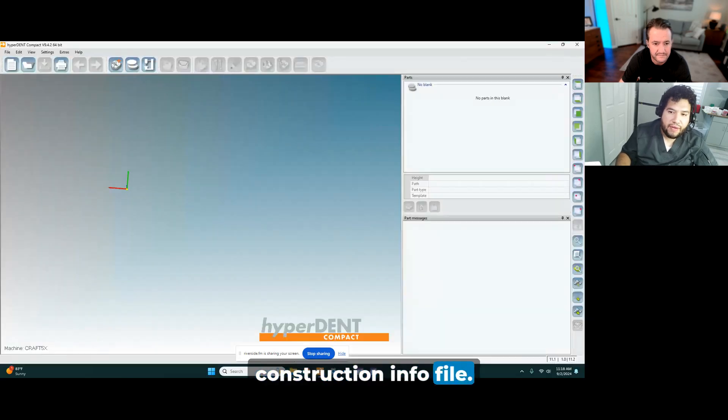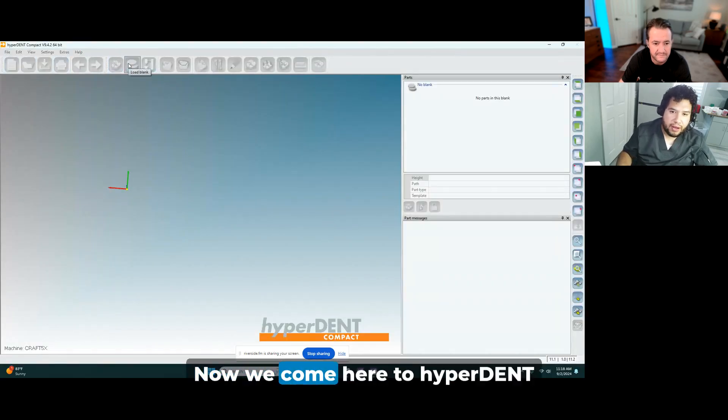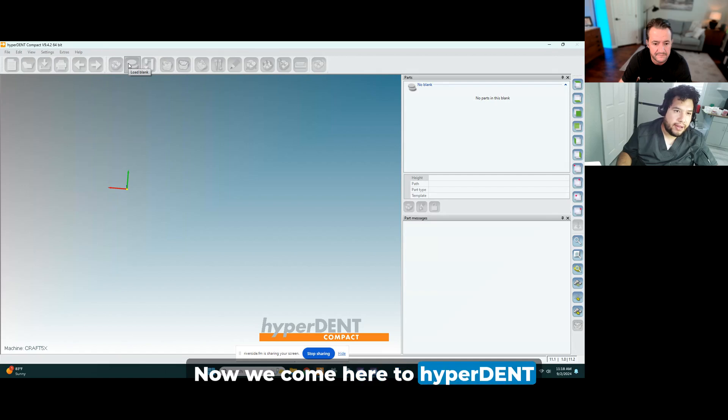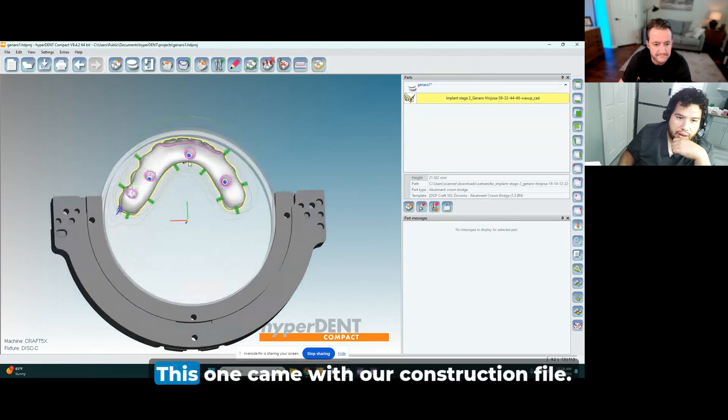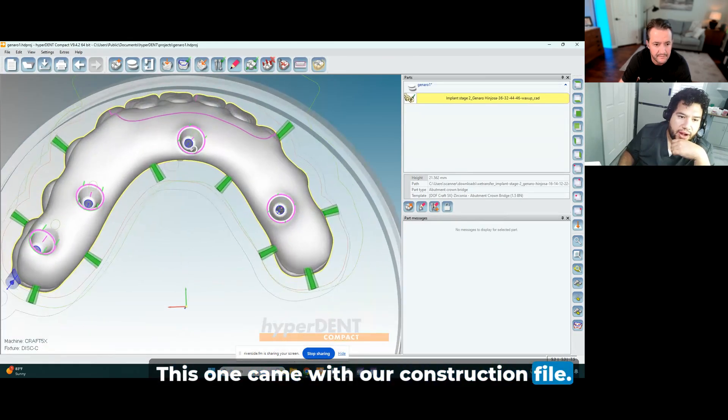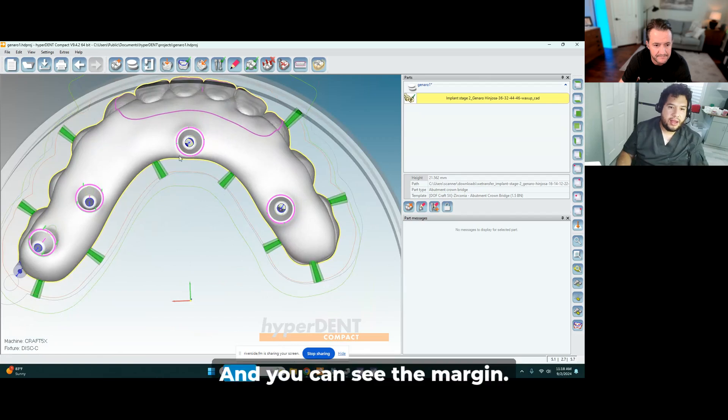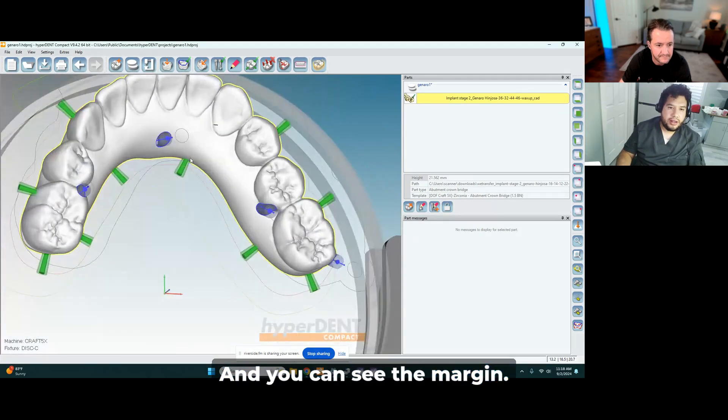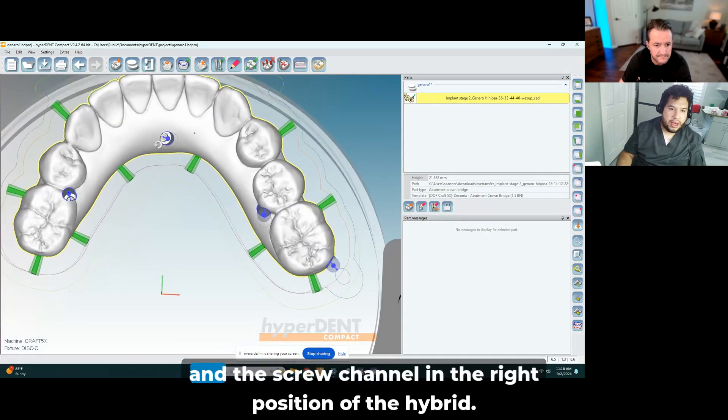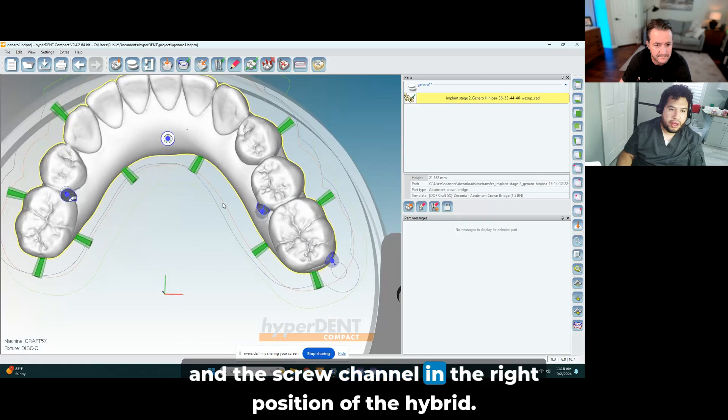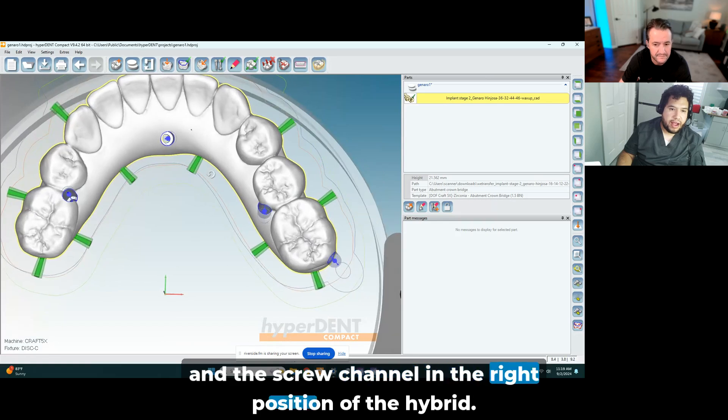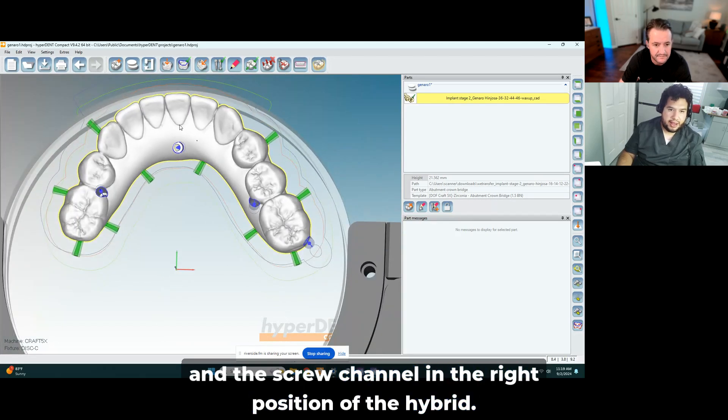But we make sure we get the construction file, construction info file. Now we come here to HyperDent, and as you can tell, this one came with our construction file.